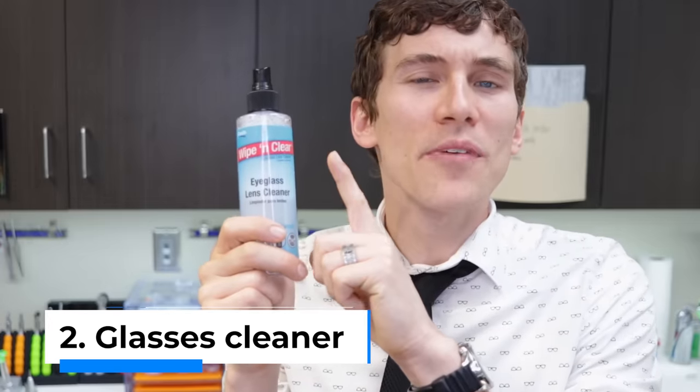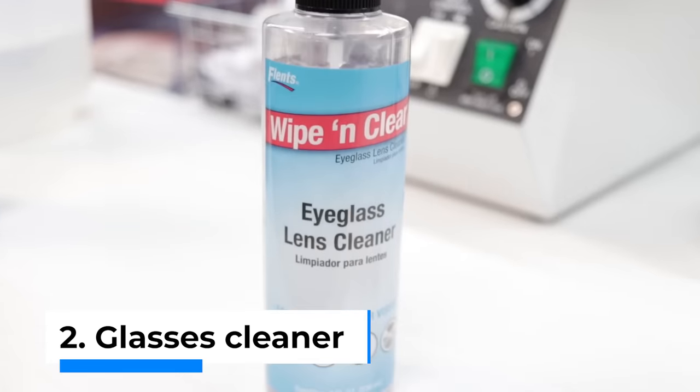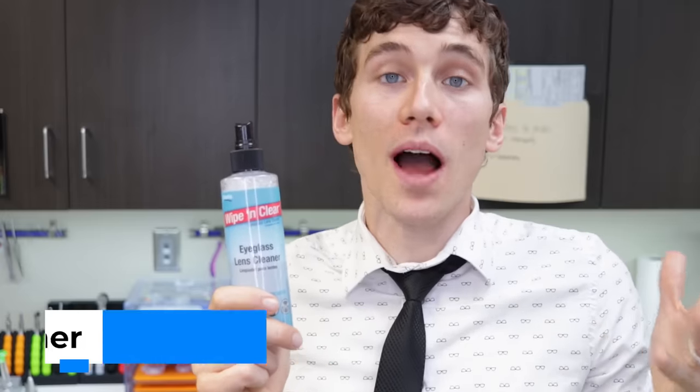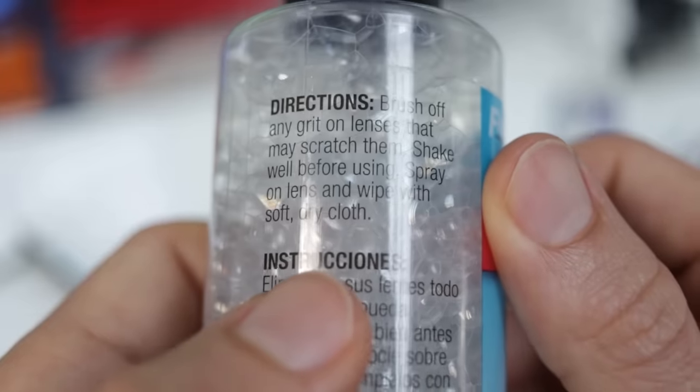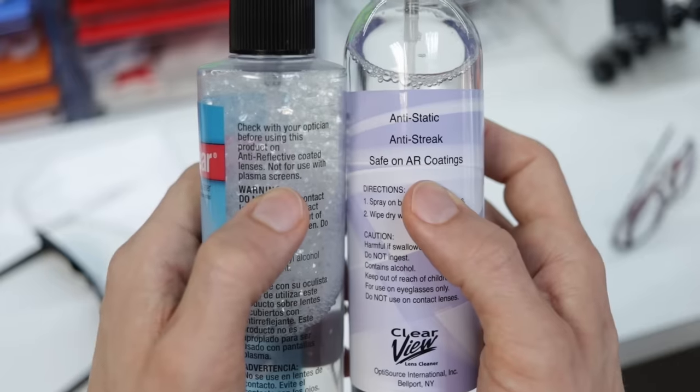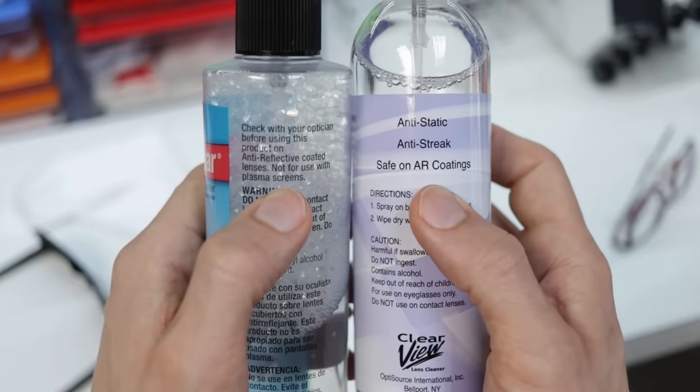Tip number two is to clean your glasses with some type of eyeglass lens cleaner. There are many different products you can find online or through your local optical store. Whatever you do, make sure you read the instructions and confirm it is safe to use with AR coatings — that stands for anti-reflective coatings. Most glasses have an anti-reflective coating to reduce glare. Some cleaners can be pretty harsh and can actually strip off that protective coating, so you don't want to ruin your glasses.